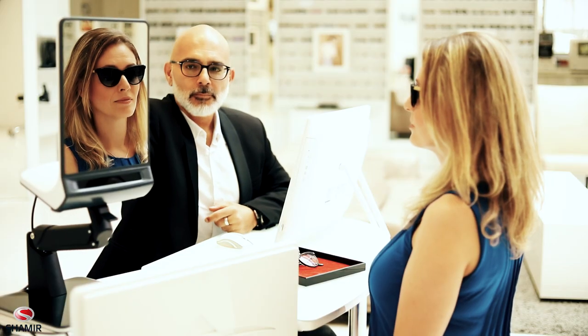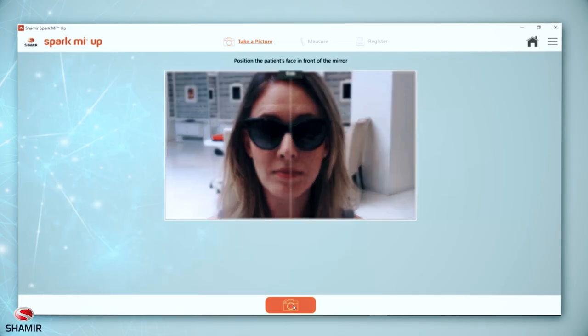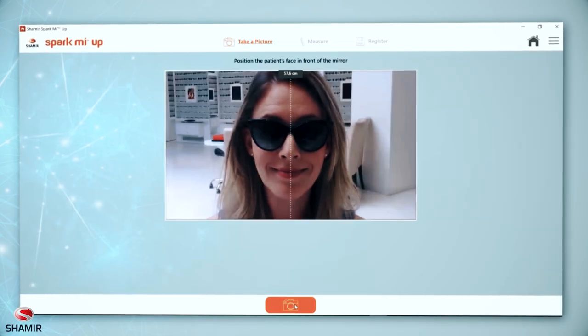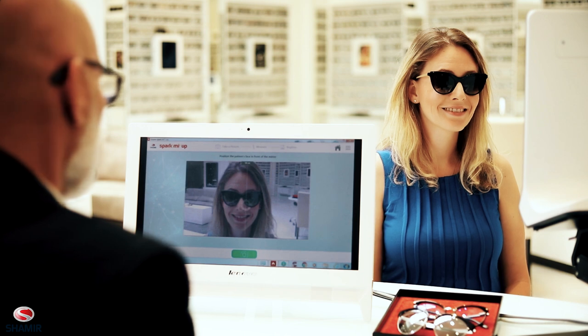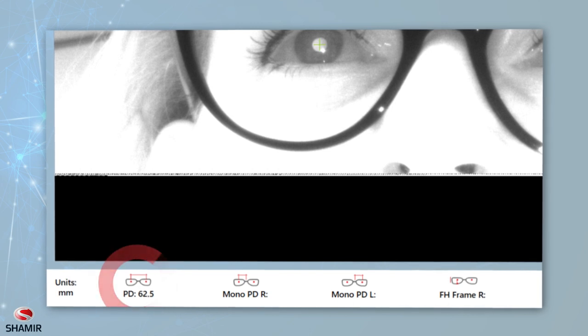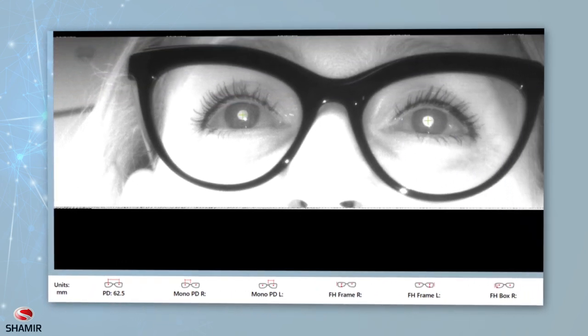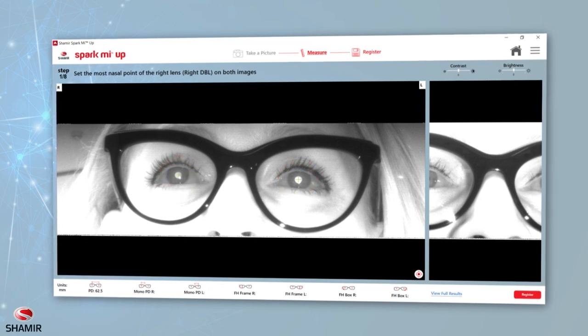Adjust the height of the SparkMeUp device so that the patient's face is in the center of the mirror. Make sure that the patient is looking into the mirror, maintaining his or her natural posture while focusing on the frame bridge. Make sure the picture on your screen is clear and in focus, and wait until the camera button turns green. One picture is all that's needed for SparkMeUp to generate all the necessary measurements. Once the picture has been successfully taken, the patient's FAR PD will automatically appear in the results panel on the bottom left side of your screen, and the pupils will be marked with green crosses.